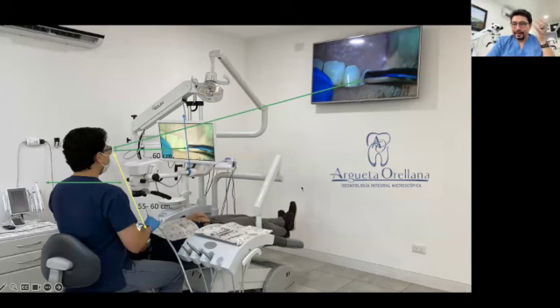The proper distance for having the best quality of 3D images and for being relaxed during the full procedure is 60 centimeters. And the distance between your eyes and the mouth of the patient is around 55 to 60 centimeters as well. If you go farther than that distance, it won't provide you high quality 3D images.